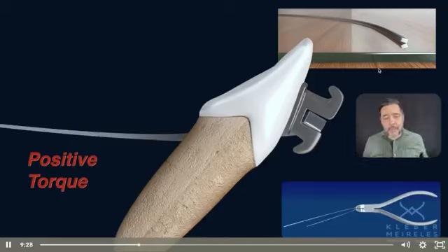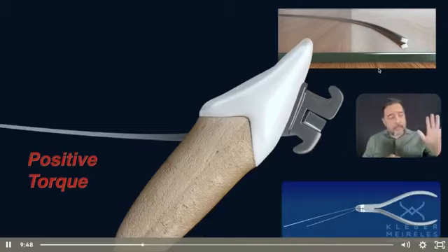Of course, you know that if I want to give a negative inclination, I just need to put the wire upside down. I just need to invert the position in which I'm inserting the wire. It's going to give the opposite torque. But if I keep the position and just remove it from the upper and insert it in the lower, I'm giving opposite torques. Negative upper, positive lower.